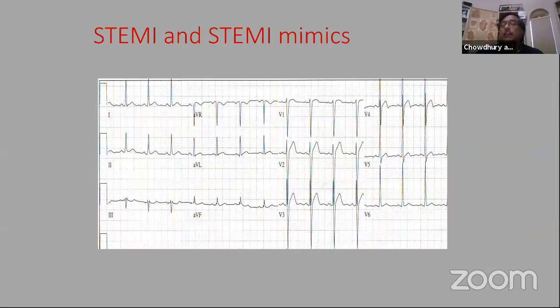And in the ER, they will be dancing on your nerves. Yes, Dr. Chowdhury. Actually, in V4, V5, my first diagnosis was STEMI. I considered the LVH second. Right, but the LVH is there.